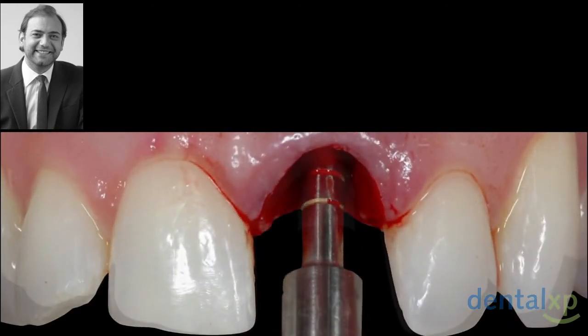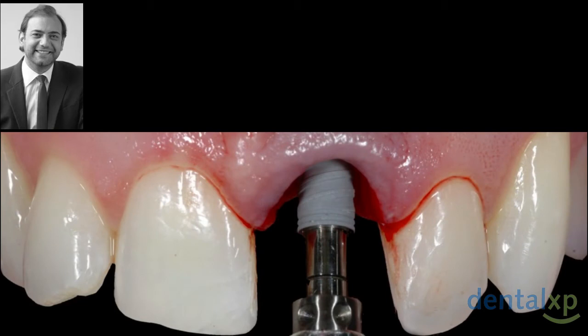And please notice with me where the margin already is, because this is reality and not like many times we see in articles and on podiums. When we're dealing with thinner tissues, already the margin moved apically, and we're losing the game. So if we go and support this margin in order to keep the tonus in the area, we push it further apically. So we either soft tissue graft or we do the marginal migration restorative concept.